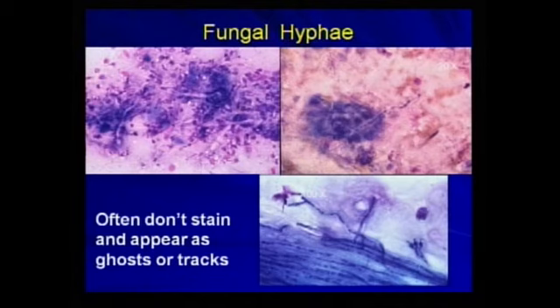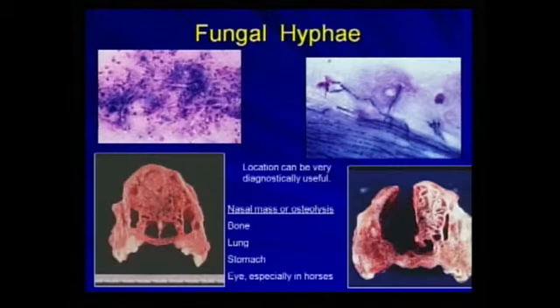The stain in the bottom right-hand corner was taken from an ulcerated area in the cornea of a horse. Just a wonderful stain. That's a once in a lifetime, and you can even see the fruiting body of this Aspergillus. Lovely, lovely picture taken by Don Mutin.